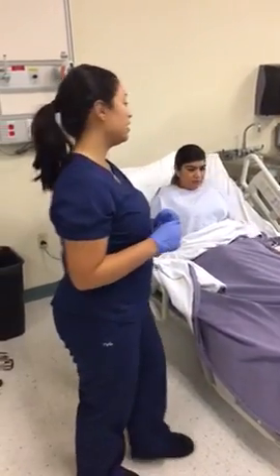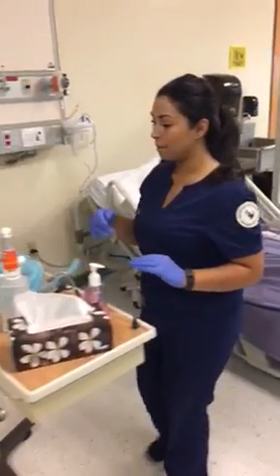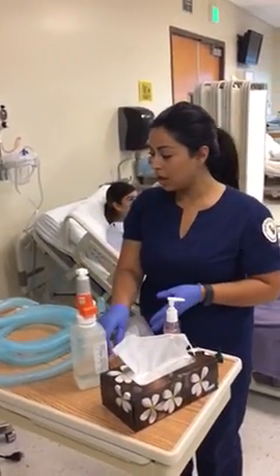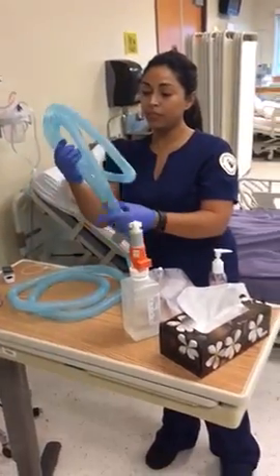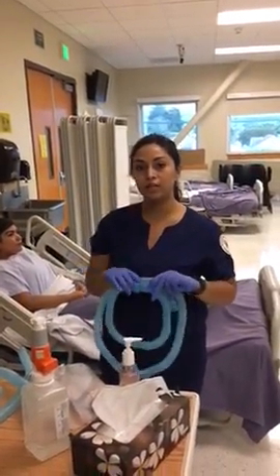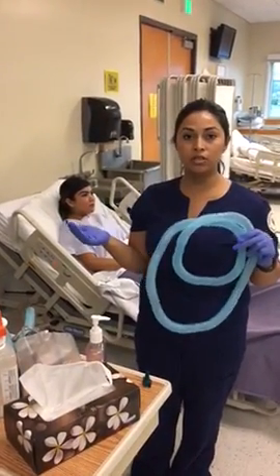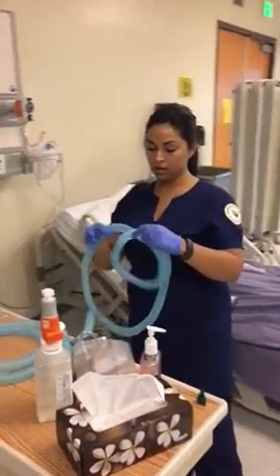So I'm going to go ahead and get ready to put everything together. It will take me a minute. Okay. So first I want to get my equipment ready, and I will gather my tubing. You don't want the equipment to touch the floor because there's a chance for contamination. So by any chance that it does fall, all you have to do is grab a clean one and go back to assembling your equipment.